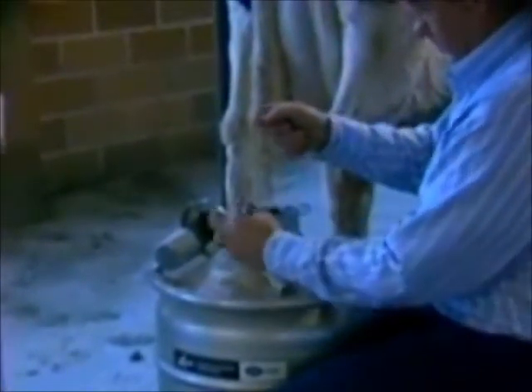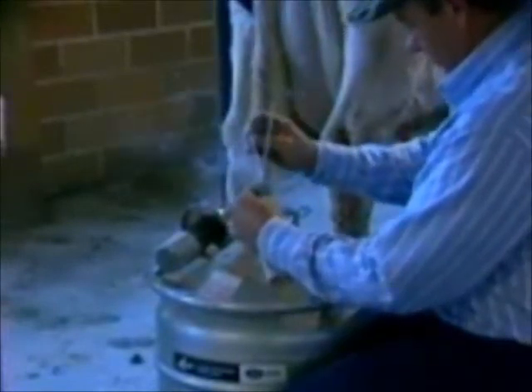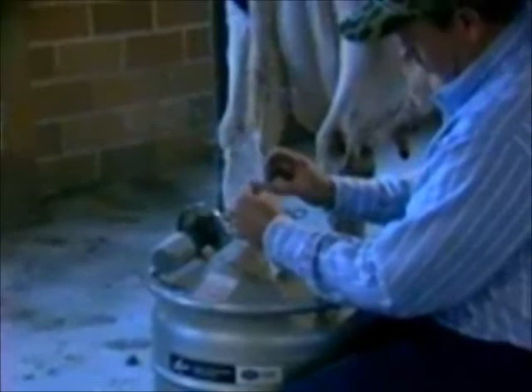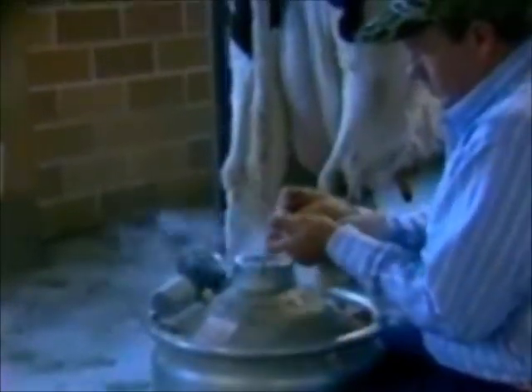When handling semen, one must not bring the canister completely out of the tank, but work down in the neck, which we call the frost line, which can be seen. The cane then can be brought up with the semen that you're interested in. It should be brought up, dropped down immediately, then the canister, and then we can immediately go and drop that into the water bath.